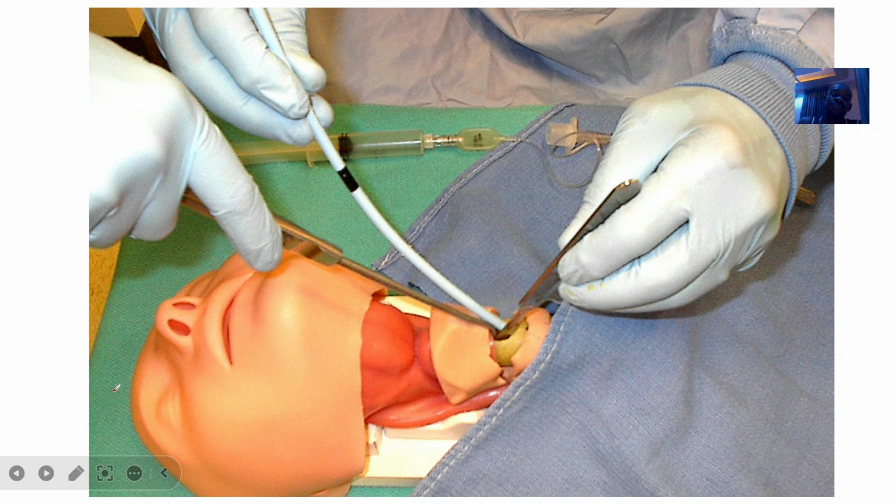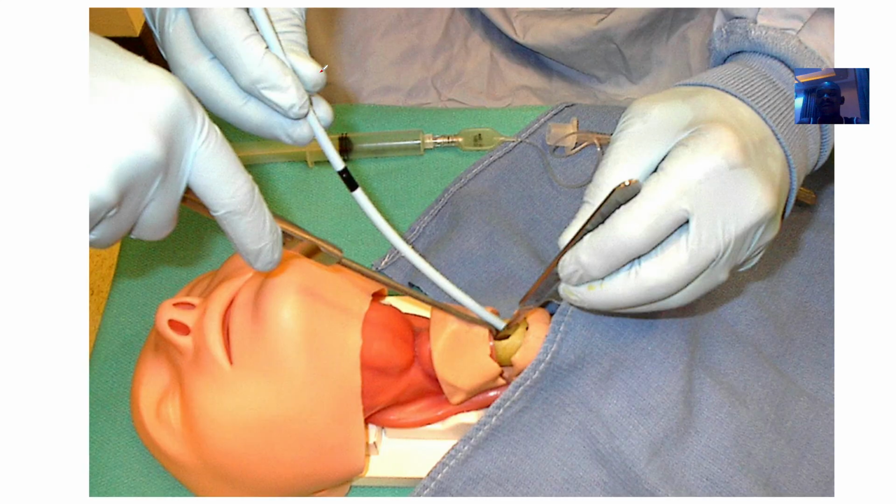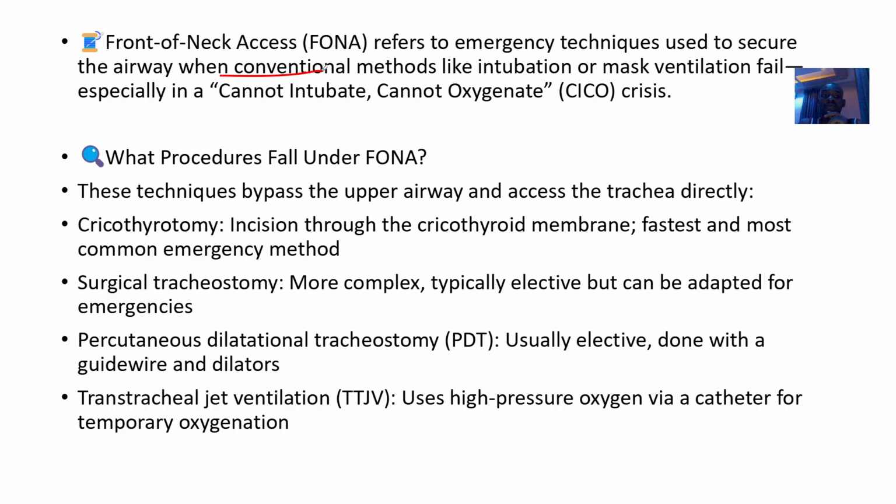I tried to intubate the person maybe through the nose, through the mouth, it has failed. So I just have to cut the neck open to intubate directly into the throat. You understand? So it just refers to what emergency technique. You are using it to secure the airways when normal methods of intubation and masking the patient for oxygen delivery has failed. Do you understand? So that's a condition known as cannot intubate, cannot oxygenate crisis.